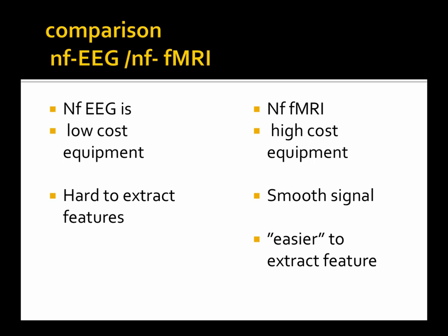While the signal seems easier, actually extracting the features, or having the subject manipulate those features, is a lot more complicated. We'll see some examples, but if you try to extract what's unique when the subject is doing something on the EEG, the signal to noise is very low, you require a lot of averaging, and the training is not that easy.